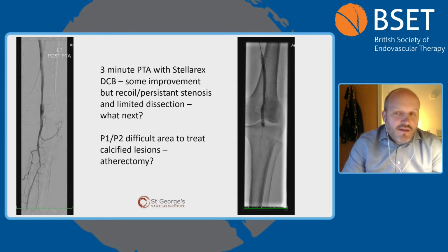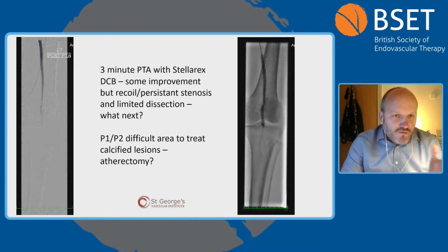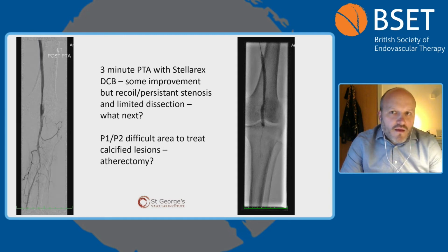And at that stage, we're wondering again, do we intervene? Do we not intervene? Is better, as the old phrase goes, the enemy of good, and should we just leave that? I didn't feel again that we could leave that. There's actually a number of different views, with the C arm in different planes, where that stenosis was more significant than it looks there.